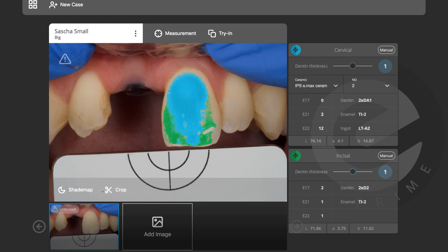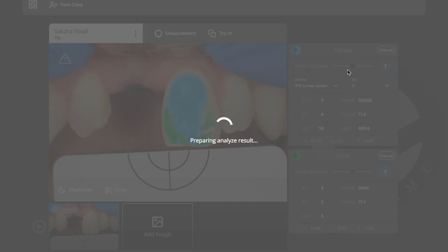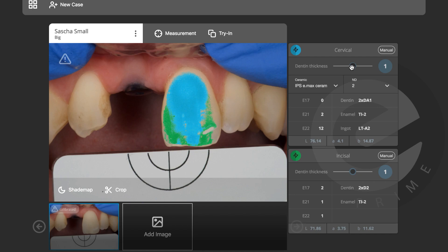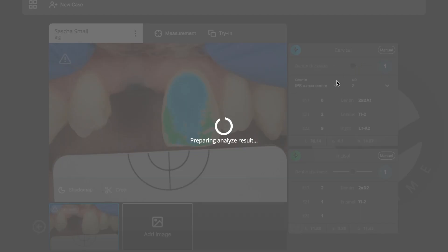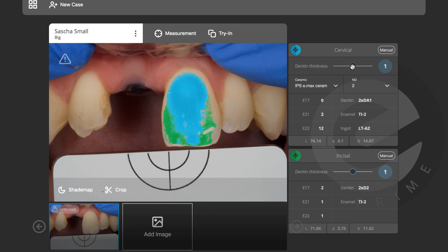eLAB Prime is suggesting that the cervical area is dentin mixture one and the incisal area is dentin mixture two. We have three thickness options: 0.5mm, 1mm, or 1.5mm of layering. You can see the mixture changes as you switch options. I'll go back to 1mm since I know I had 1mm of space for layering. These are the mixture numbers for the blue cervical area and the same for the incisal.